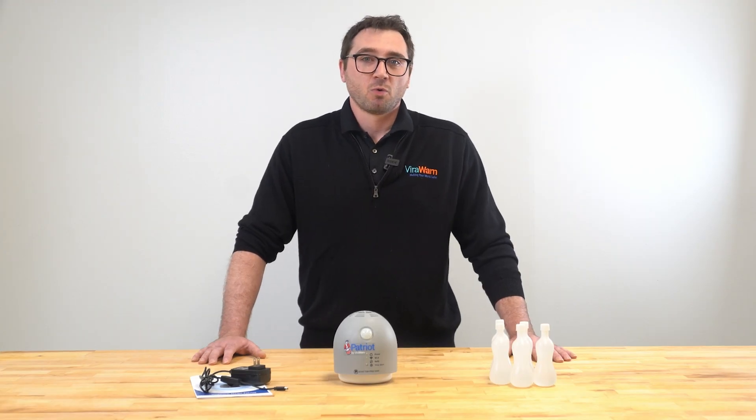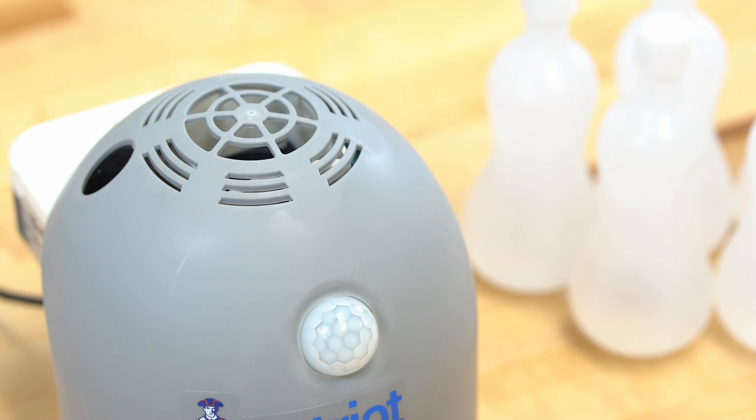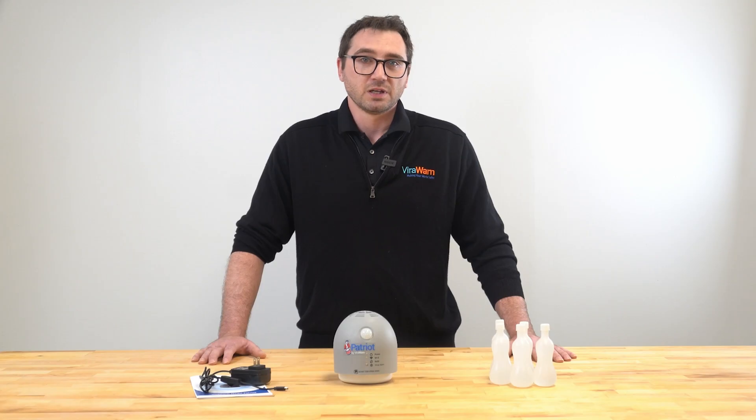At the top of the Patriot by ViralWarn, there is an internal fan. The fan is an intricate part of the device's detection monitoring. If you listen, you will hear the sound of the fan running. In order to conserve the liquid media from exhausting too quickly, there is a default automatic turnoff feature. In the default configuration, the fan will automatically turn off after 10 minutes of runtime. Once the fan is turned off, Patriot by ViralWarn will cease detection monitoring. After 10 minutes of runtime, the default automatic turnoff feature kicks in, putting the device into sleep mode. During sleep mode, the fan is no longer running and the device is no longer monitoring.